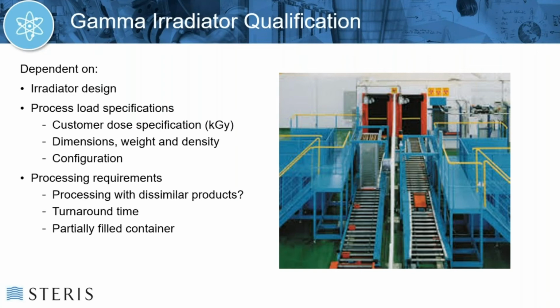Processing requirements. Do we want to be able to process with dissimilar products? Do we want to prioritize turnaround time? Do we want to minimize the effect of partially filled containers? These are all things we have to consider when we decide to qualify an irradiator.